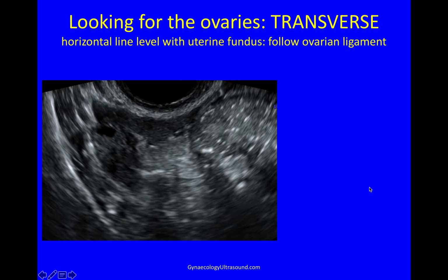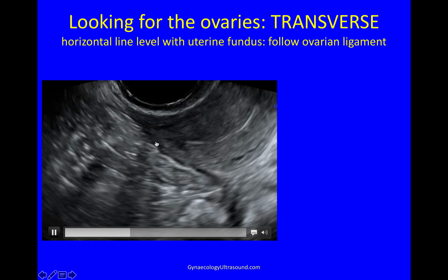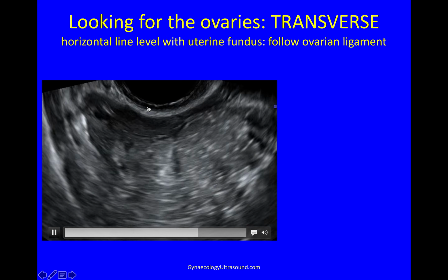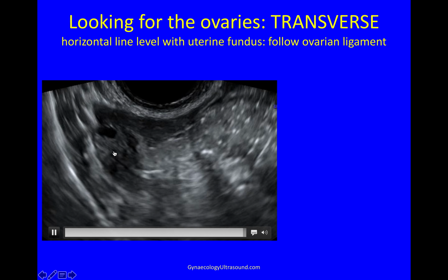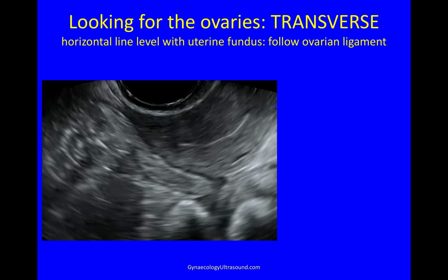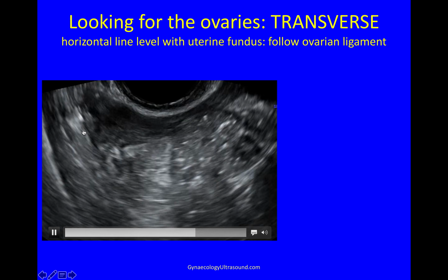So we'll just do that again in a minute. Longitudinal view of the uterus, aim for fundus, go transverse, interstitial portion of fallopian tube, ovarian ligament. There it is again, ovarian ligament, and there is the ovary on the end of it. Harder to do in some people. You don't have the same landmarks to prove that you looked in the right place. And it's the ovarian ligament, it's not the fallopian tube. And you can follow it by dipping down your whole hand slightly as you go laterally.